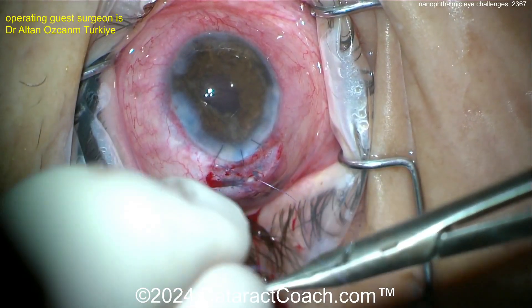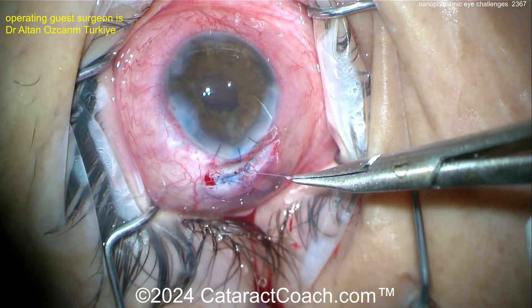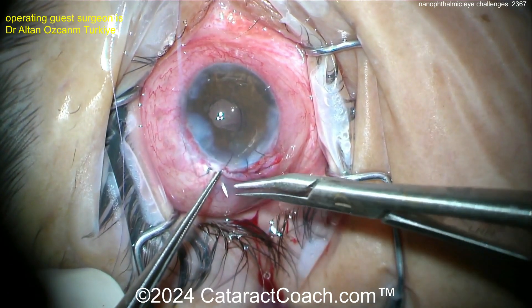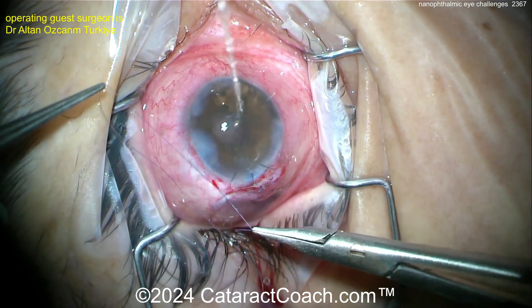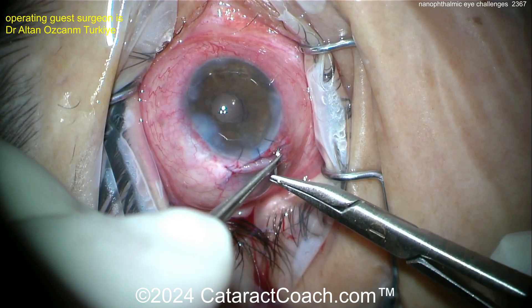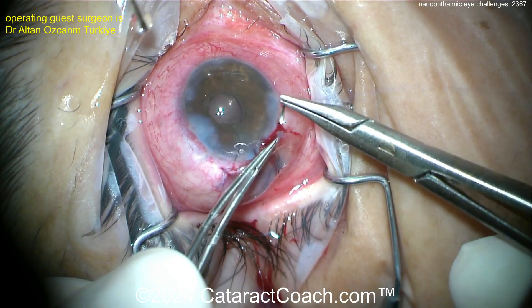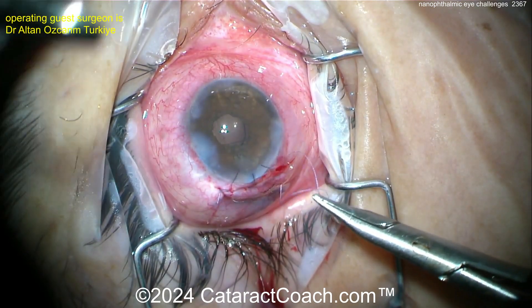For the IOL power calculations, it's actually very challenging in these eyes. Moving the effective lens position just a fraction of a millimeter changes the IOL power by a lot, and it's very hard to predict the proper effective lens position. Think about a big myopic eye — if the IOL power is near zero, it doesn't even matter where the ELP is. But when the power is 57 diopters, a fraction of a millimeter movement of that lens forward or back changes the refractive outcome significantly. I tell the patient not to expect a perfect refractive outcome — we'll make it better, but there's no chance of making it perfect. You weren't born with a perfect eye.